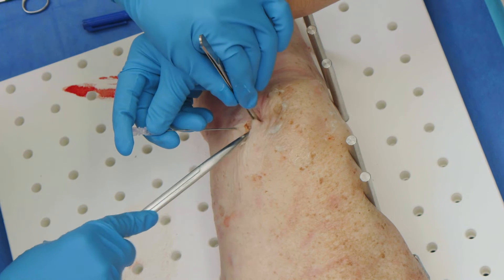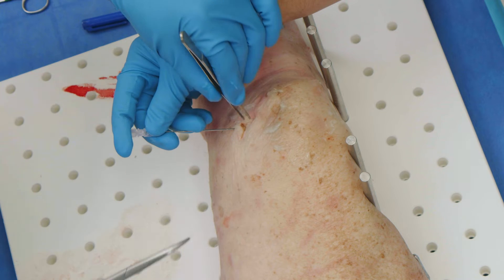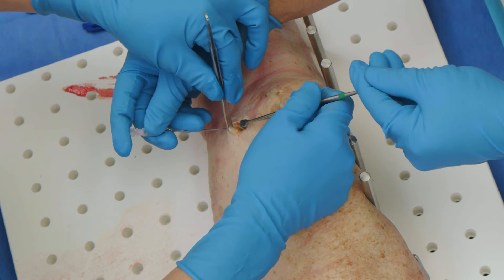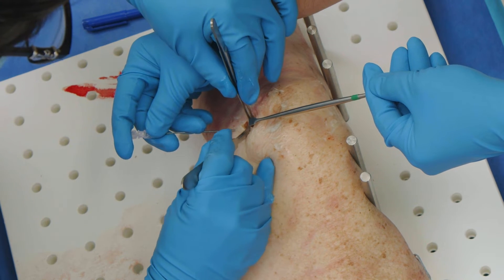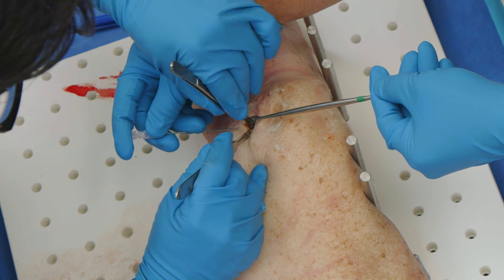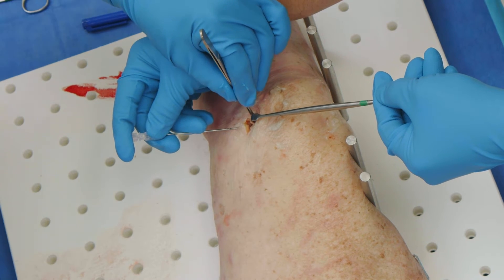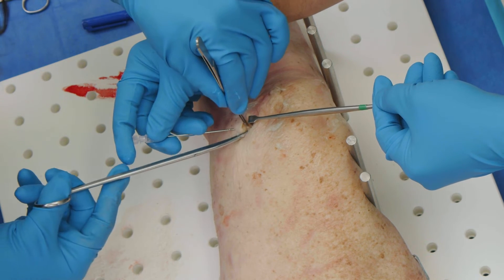We can see the MPFL right there. Obviously on this cadaver it's intact, so we're going to incise it — sometimes you can actually see that it's in fact torn at this region. I'm going to size this off the bone. Now that I've opened up the MPFL, I can actually get under it — remember it's a ligament — and I've now freed it up fully.